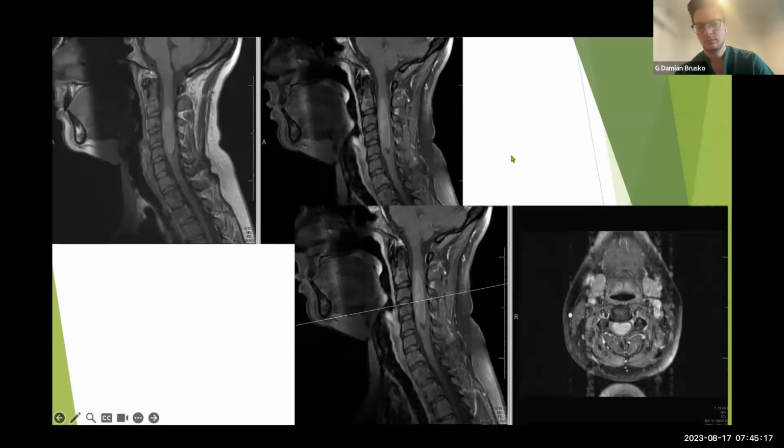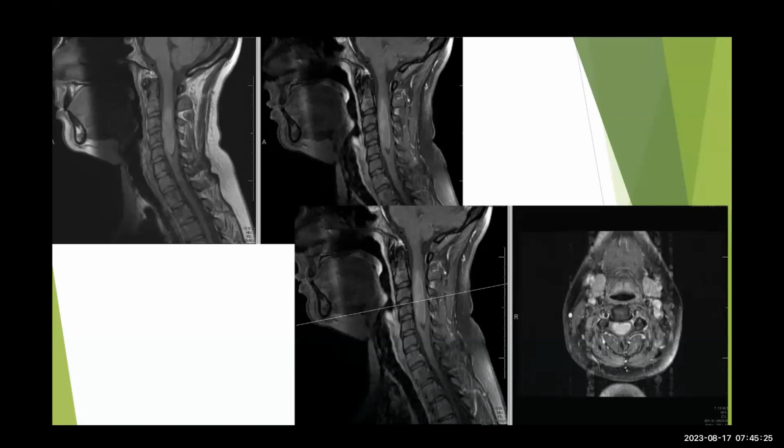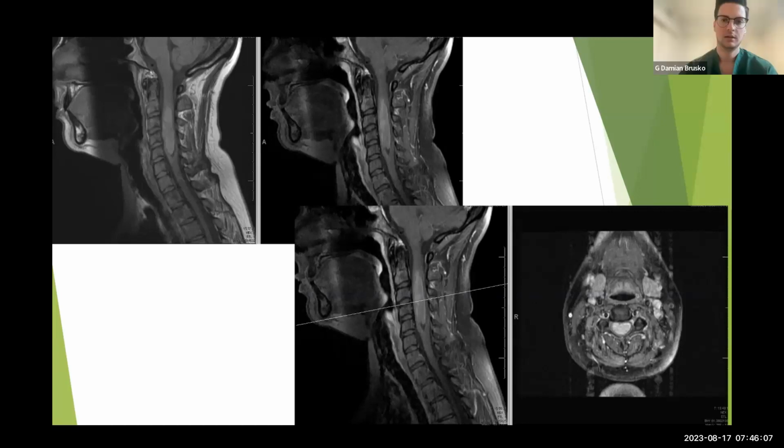So based on the location here, what do you think the differential could be for this? Like ependymoma. What else? Intradural, intramedullary. I would expect it to be contrast enhanced if it was an astrocytoma or something like that, and not cystic. What else is up here? Anything else that is often intramedullary and associated with cysts, in the spine or the brain? Oh, like a pilocytic astrocytoma. Not sure. Hemangioblastoma. Oh, hemangioblastoma.